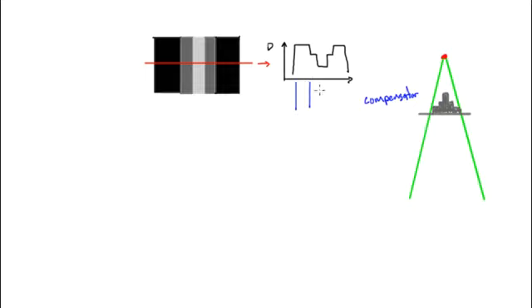So let's look at these different regions. And what you see here is if you draw the profile of the compensator, the thickness is kind of like the mirror image of the fluence map, although you have to correct for some other effects like scatter and so on that are in the compensator. But the basic thing is that the compensator is always on, quote unquote. At any point under it, it's delivering the dose rate, dose per unit time, that you want it to deliver. And so it's a very efficient way of delivering dose.